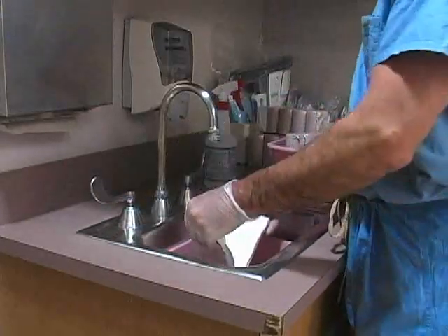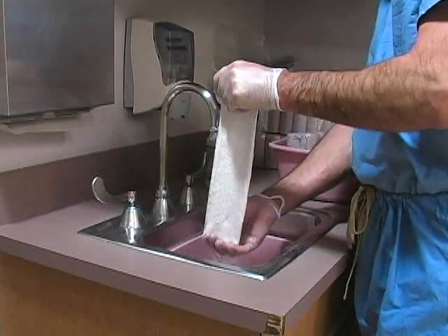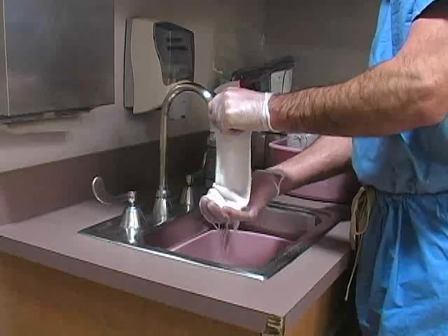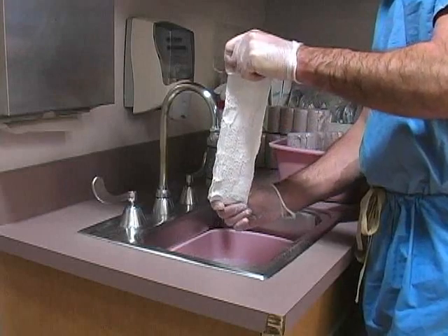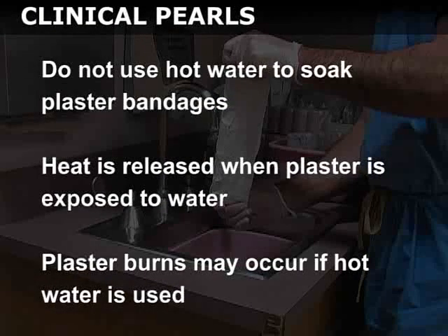Soak the layers of plaster in a bucket filled with room temperature water. Once saturated, raise the plaster above the bucket, firmly holding each end of the roll in your hands. Remove excess water by allowing the plaster to fold upon itself and then gently squeezing the layers. Do not use hot water to soak the plaster bandages, as heat is released when the plaster is exposed to water and plaster burns may occur.